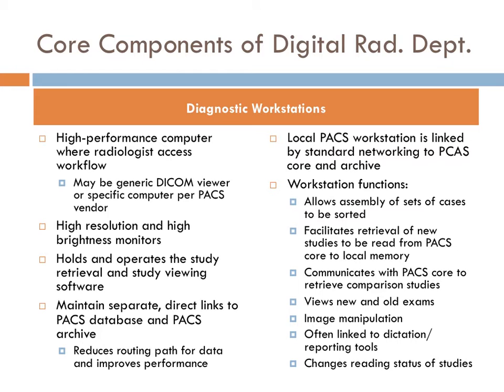Diagnostic workstations have high resolution and high brightness monitors, which obviously are needed when a radiologist is making interpretations. It holds and operates the study retrieval and study viewing software on the workstation. And it maintains separate direct links to PACS databases and PACS archives. It reduces the routing path for data and improves performance. A local PACS workstation is linked by standard networking to the PACS core and archive.